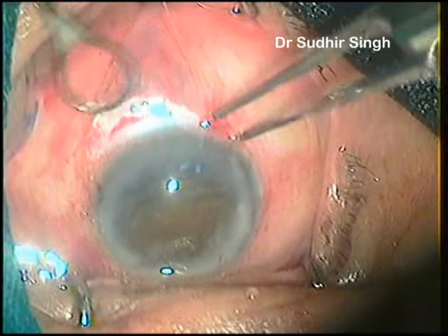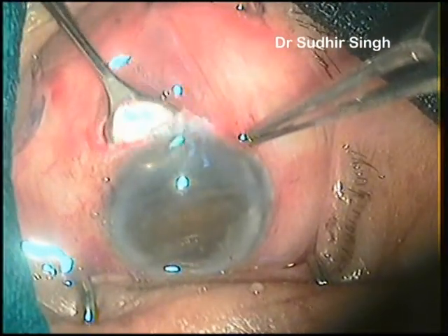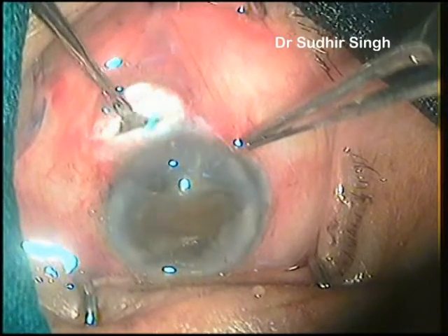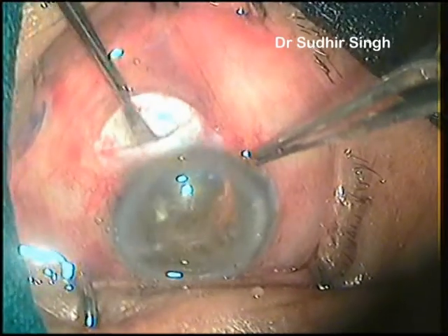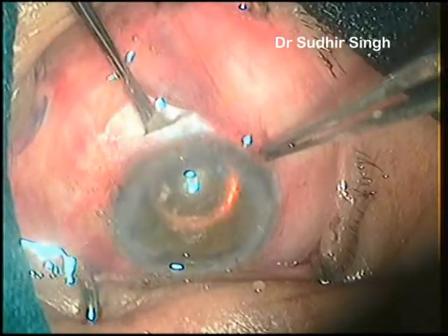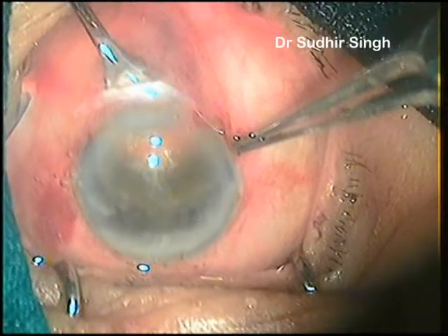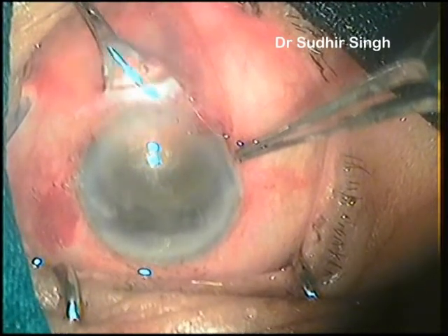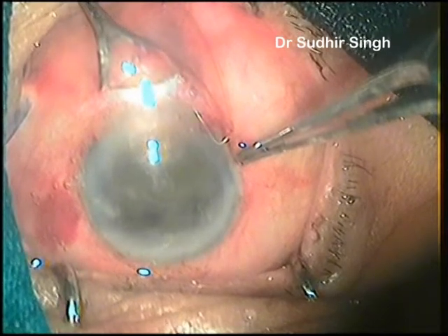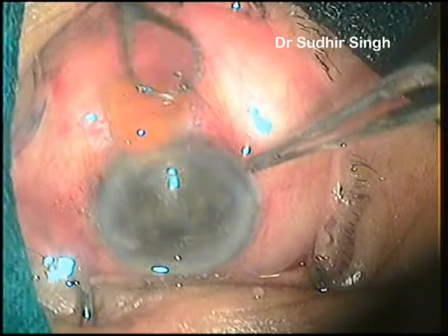The vectis is introduced by pressing the posterior lip of the tunnel and the nucleus is taken in the lap. Then the vectis is pulled out parallel to the tunnel floor along the nucleus while simultaneously keeping the posterior lip pressed. This causes the entrapment of the nucleus in the tunnel. Now the vectis handle is lifted about 45 degrees away from the limbus and then pulled out. This causes the breaking of the nucleus inside the tunnel.